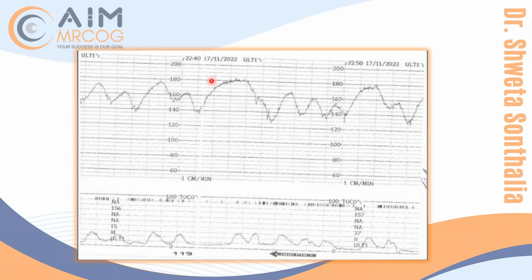Definitely it is not acceleration. This is overshoot. You see, this is the deceleration. I thought that it could be one. Yeah, you're right. So why I thought 160, because if I match the deceleration, most of the decelerations, the upper part is starting going at 160. Yeah, you're right. That is what I'm telling.